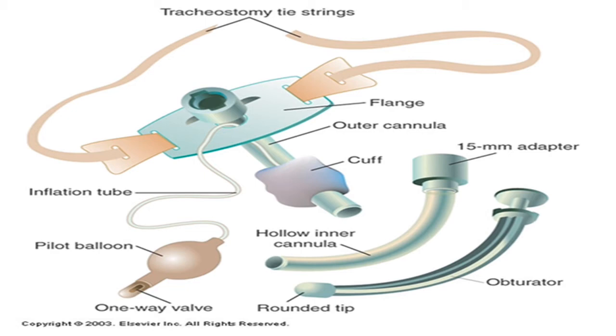When we talk about changing the ties out, we recommend having another person there just holding the tracheostomy. If a patient coughs, they can cough that tube out. The cuff is going to provide a little bit of protection as well, but a forceful cough with a tube that's not properly secured can cough it out. And that's a really big deal because, again, this is the patient's airway.